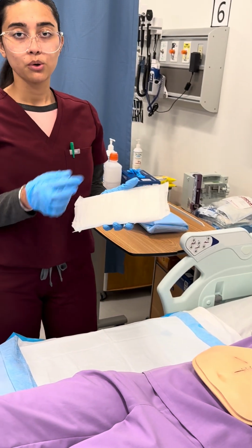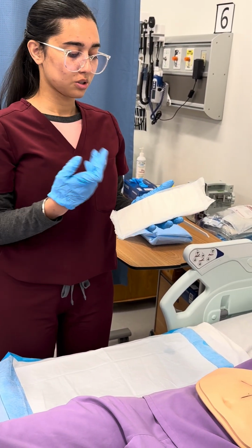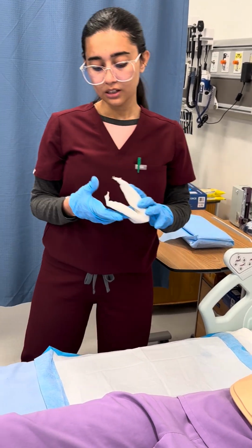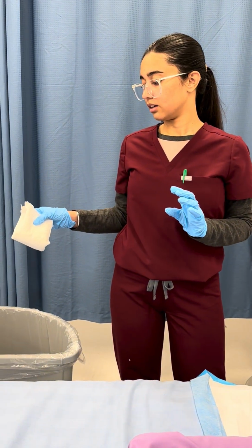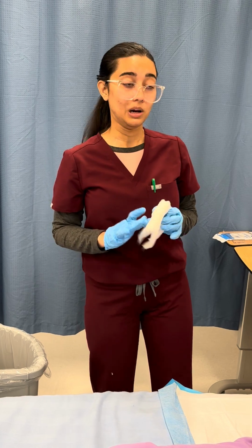So there is a small amount of serous fluid that can be seen on the dressing, and the wound is not yet dry, so a small amount of serous fluid is normal, and there are no signs of blood. Ideally I have to discard the abdominal pad, but since I have only one abdominal pad, I'm going to reuse it as a sterile one later on.